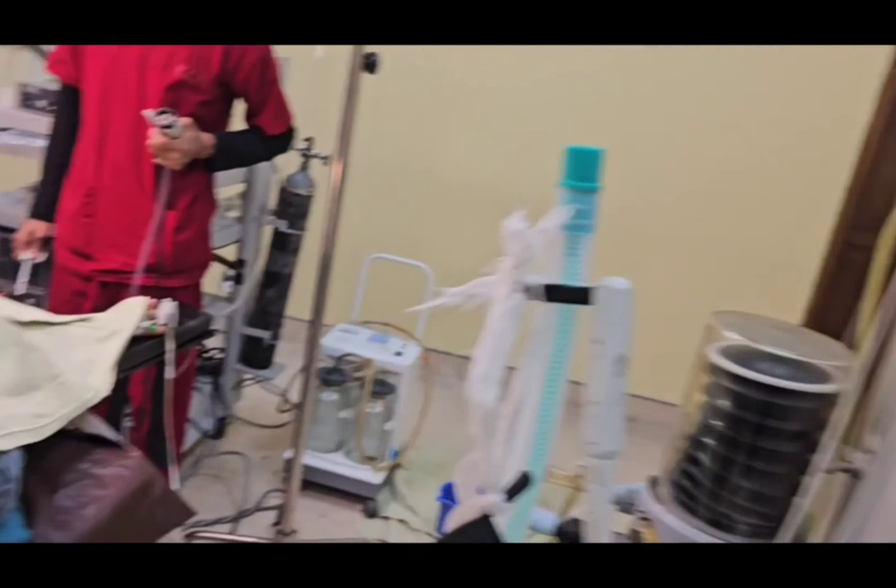Here we are ready with the reversal agents — neostigmine and atropine. We usually use neostigmine at 1 ampoule per 10 kg and atropine at 1 ampoule per 30 kg. As the patient is 70 kg, we are using the drugs according to that weight.